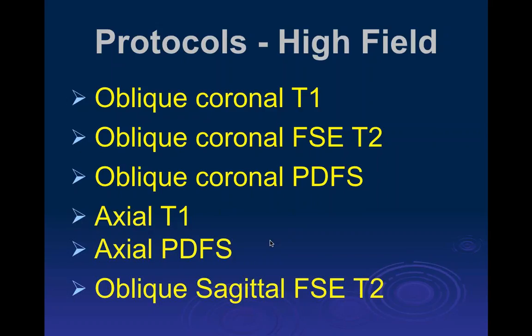And the reason for that is the fat suppressed sequences are very sensitive, but they lack some specificity, and I've found over the years, more and more now with MR imaging, that specificity, I think overall is more important. I think there's too much surgery, and it's often driven by MRIs which are overly sensitive and not specific enough. So I find that the non-fat suppressed T2s add some specificity to the diagnosis to decrease the number of overcalls on MR. But we'll go through this and you'll come up with your own opinion concerning it.